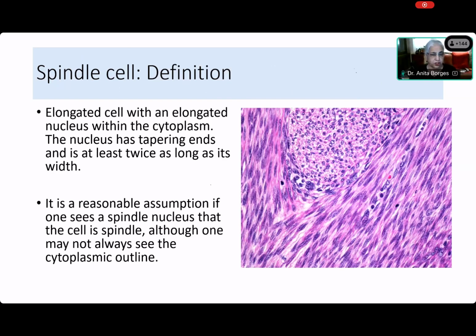What is oval to polygonal shape, Shashank? Ma'am, some are oval and some are some. That's fine. But what is oval? What are you seeing as oval? Then we'll come to the polygonal. And I assume that you are talking about the nucleus. Yes, ma'am. Okay. Good. So really, what you are talking about, Shashank, is this area, right? Yes, ma'am. I'm talking about this area.